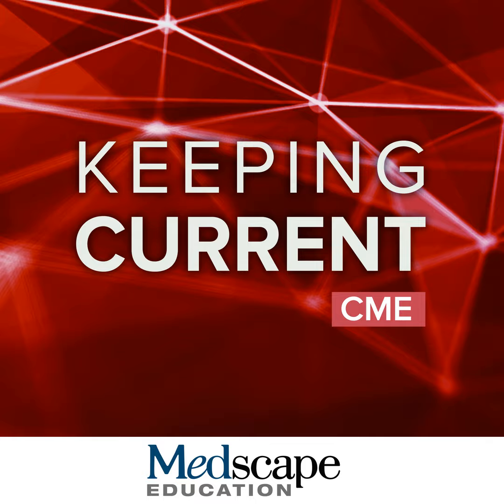The perilesional hepatobiliary phase hypointensity also predicts outcomes, which are very important for us, right? So if we look at patients who had HCC and underwent RFA, and we look at overall survival, you can see that patients who have HCCs with perilesional hepatobiliary phase hypoenhancement actually do worse, and this change is statistically significant.